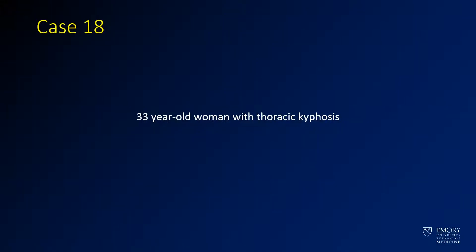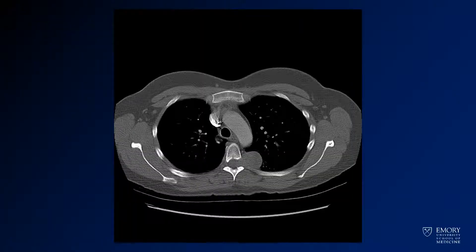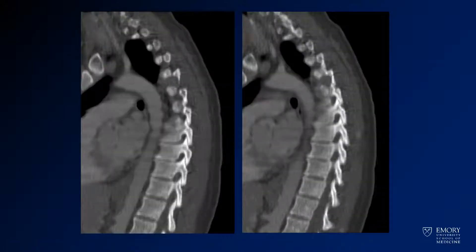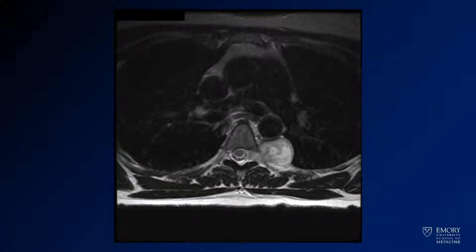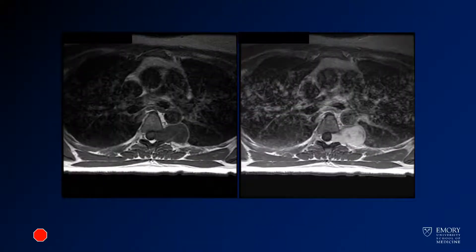Case 18 is a 33-year-old woman with kyphosis. Here you have a CT image through the level of the chest with thoracic spine. Here you have some sagittal images through that same region. This is a T2-weighted MR through the same area. Now pre- and post-contrast images through that area.